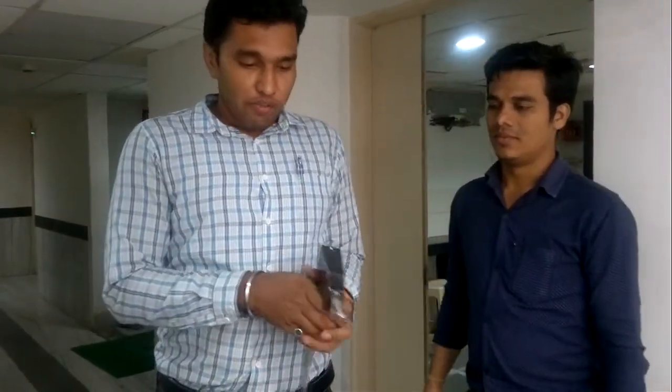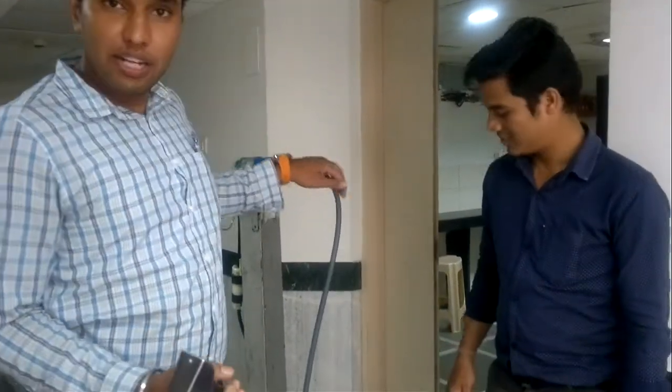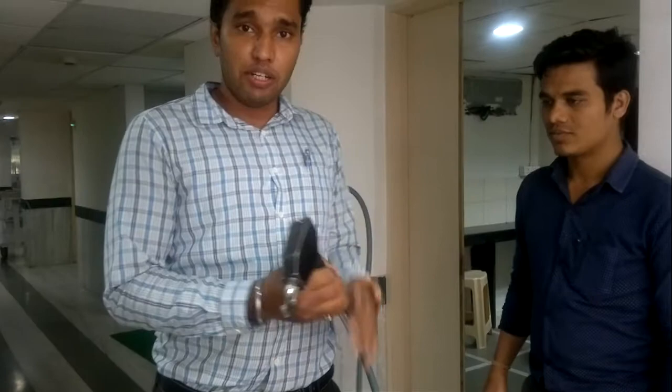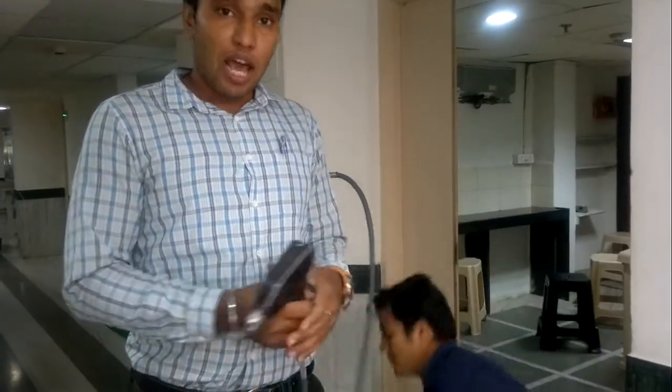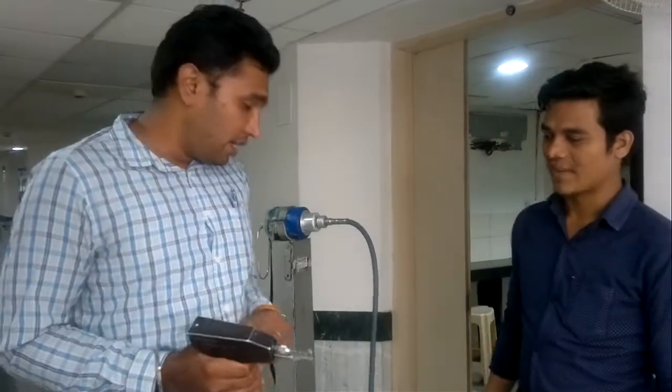It is a cutter which works with this motor and this mechanical energy is transferred over here by this mechanical cable. What it does is cut the sternum during cardiac cases — whenever we want a cardiac case, CABG, valve replacement, or something. So for that we need it.